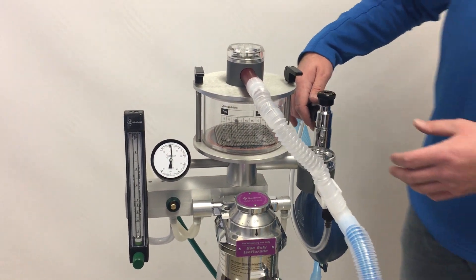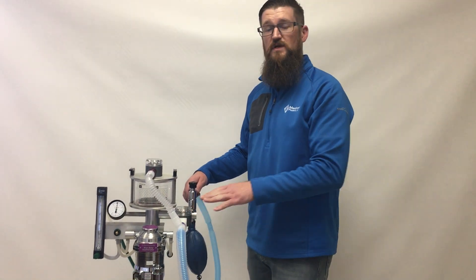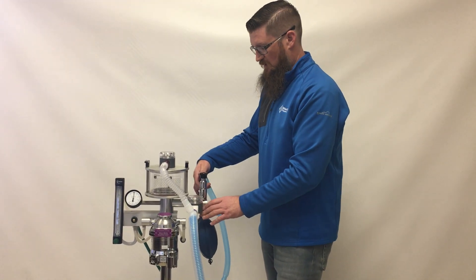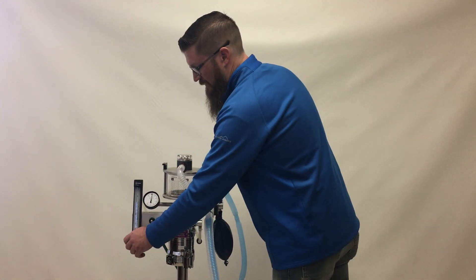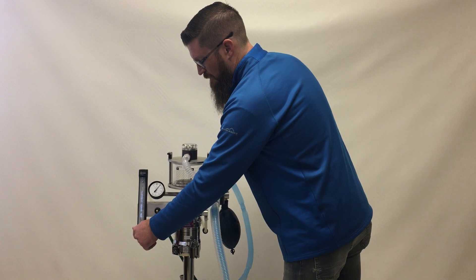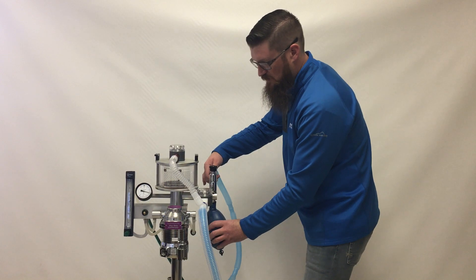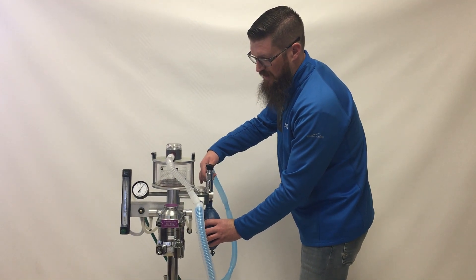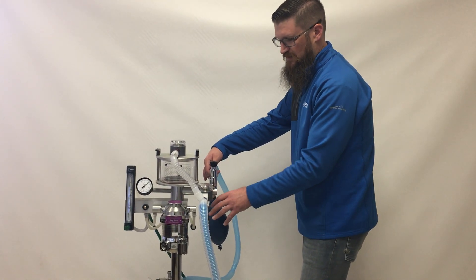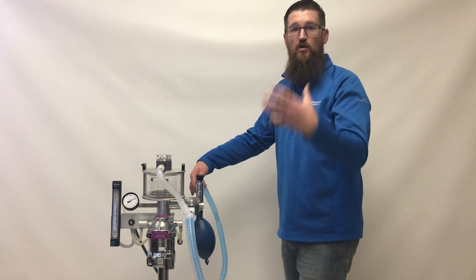A lot of questions have come in about how to bag patients with the safety relief valve in place. You can leave the safety relief valve in place when bagging patients. If you hold the occlusion valve down and build up a little pressure, you can easily achieve a higher pressure and bag the patient by giving a breath. A little gas will escape, but not enough to completely deplete the machine.